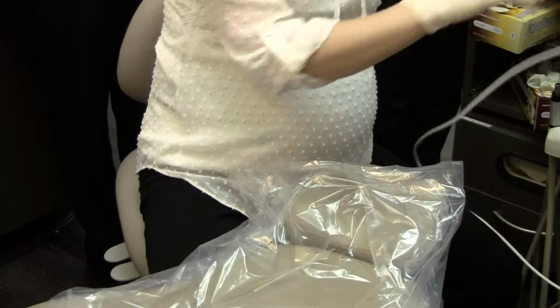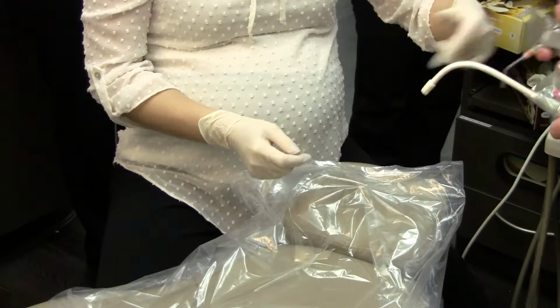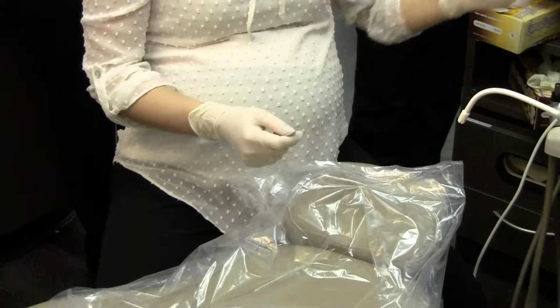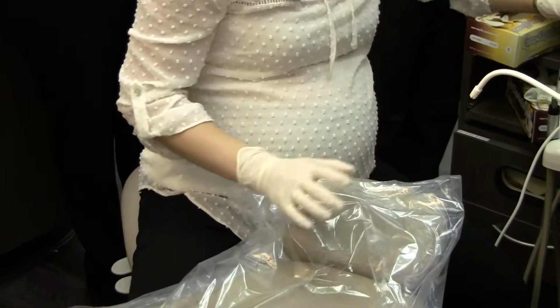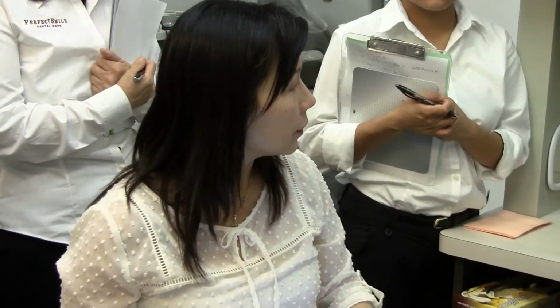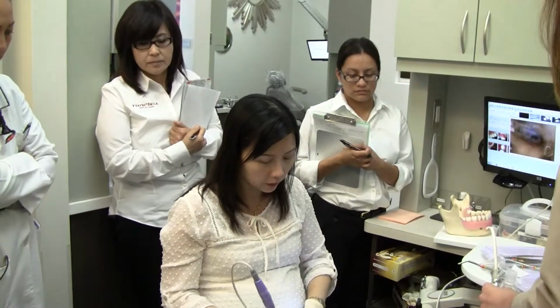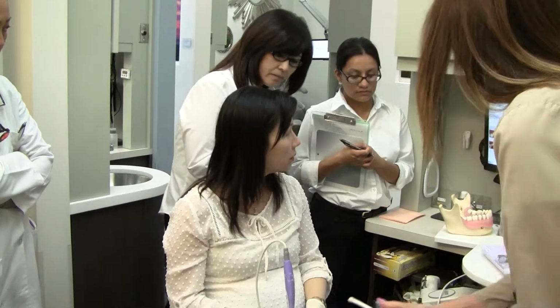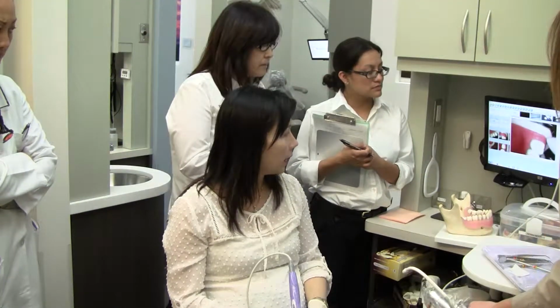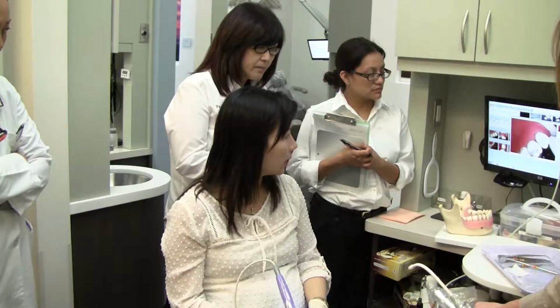So basically, roll back a little bit during the exam. Brittany held low air so it'll go faster, and then she moved to the next X-ray. And then now that we're done, we take the photos. So we're just going to show our front team how to take photos first. Let's say blow some air. And you want to wait until I focus it, I say go ahead.